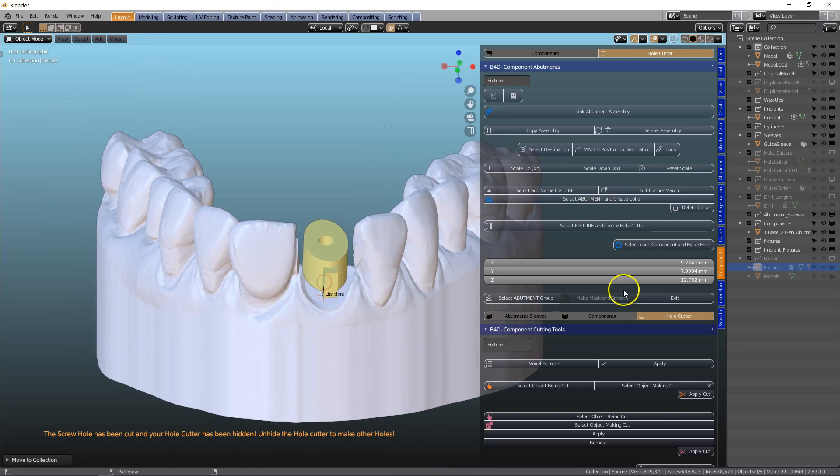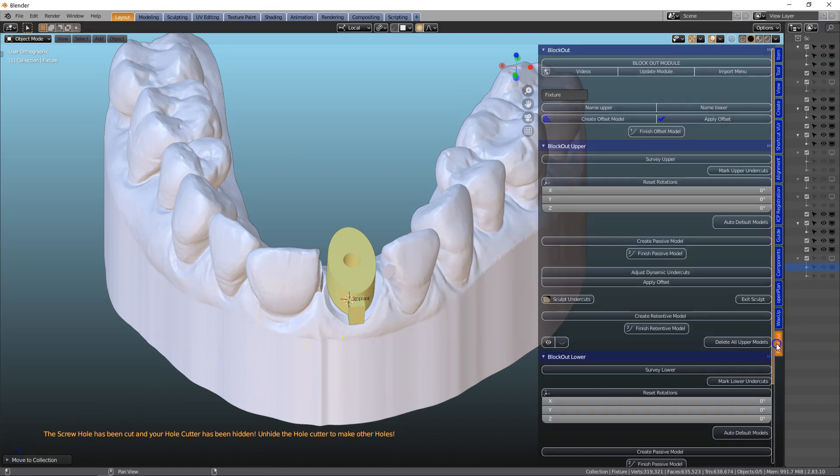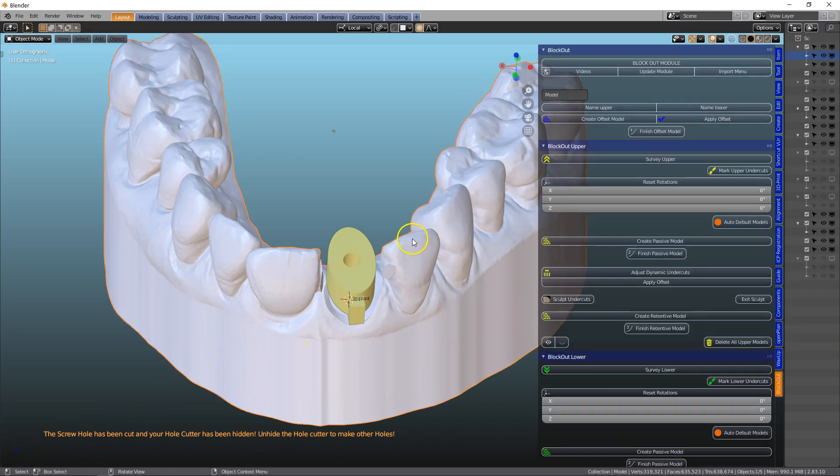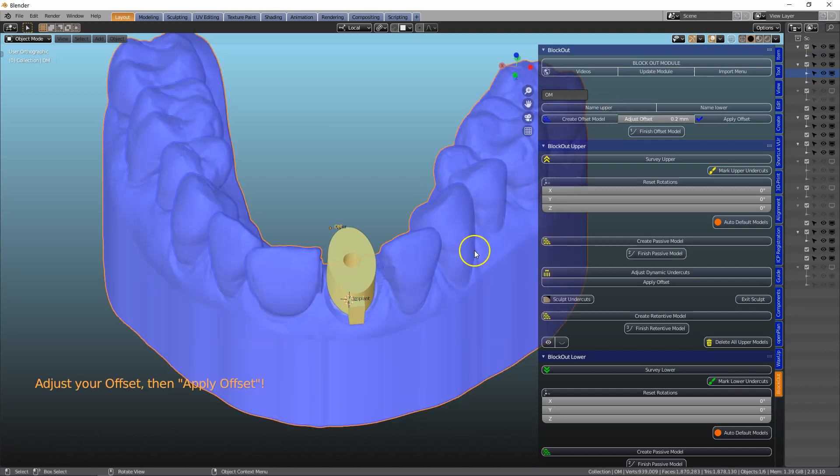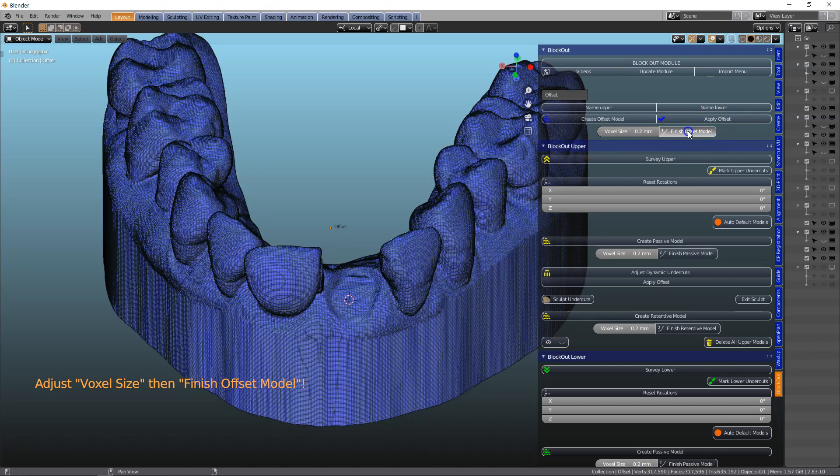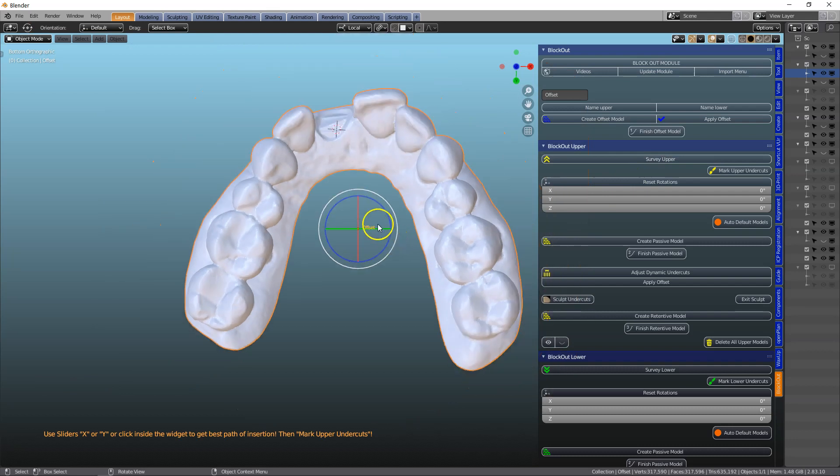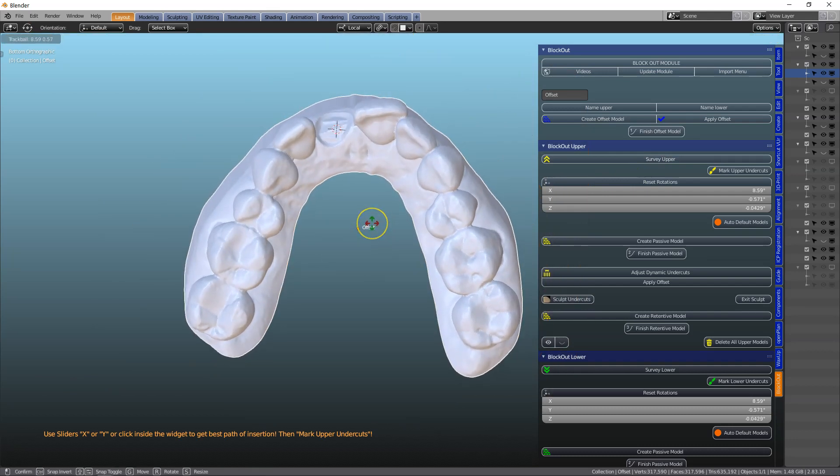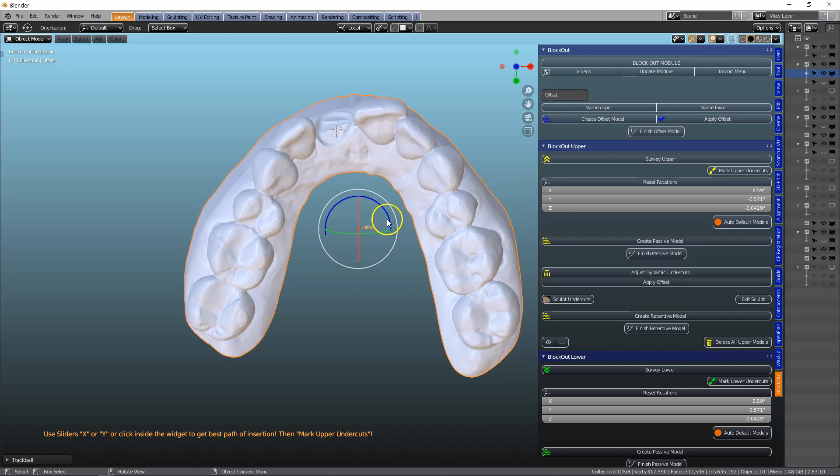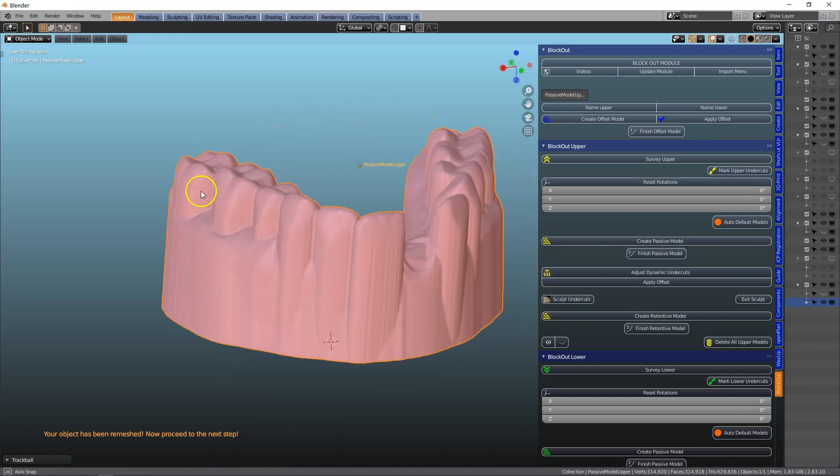And then let us make our guide. But we need a blocked out model to make our guide. So I want to select that. That becomes my upper model. We're going to create an offset. Leave it at 0.2. We're going to create this offset model. And then block out the undercuts. Let's survey the upper, get a good path of insertion. Create a passive model. Finish this model.